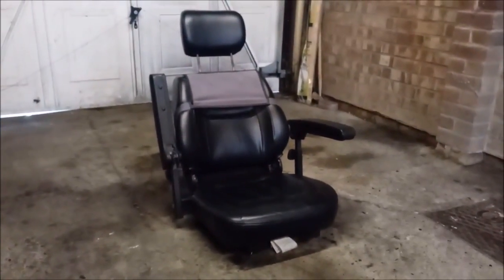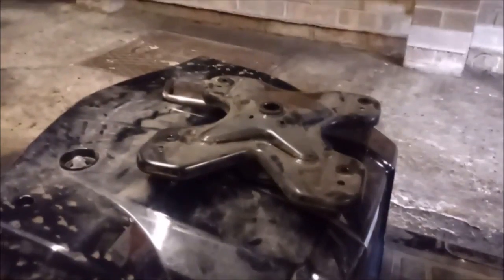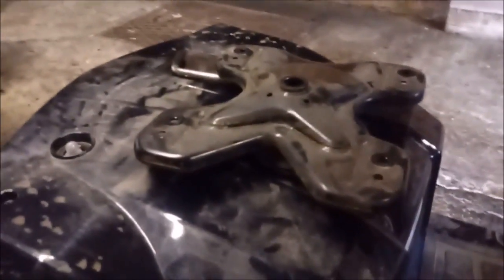Okay, first you have to remove the seat, and that's held on by 4 13mm nuts and bolts with washers, with studs and washers. Then we've got to get under there to get that bolt out, to get the stem out. After taking the seat off, under that black grommet there was a pinch bolt going through the stem to hold the seat in place, and then we can just lift the stem out and put that to one side. Put that over there, take that off of there.